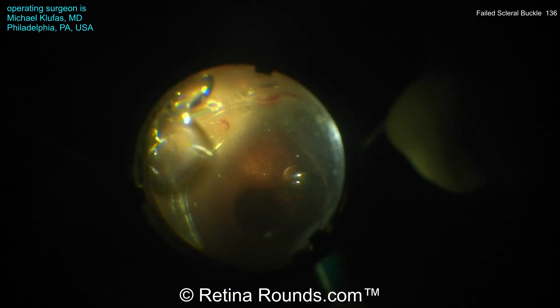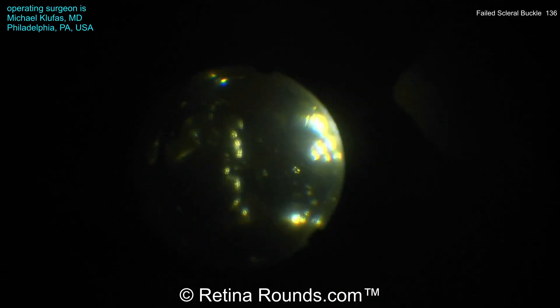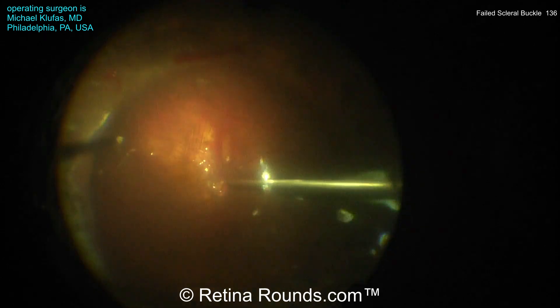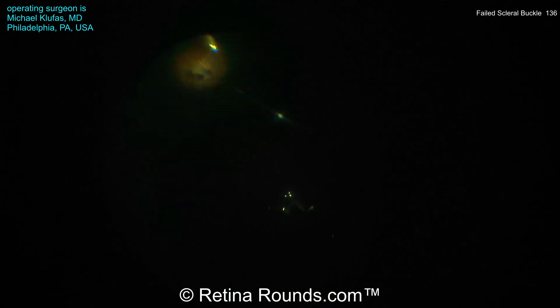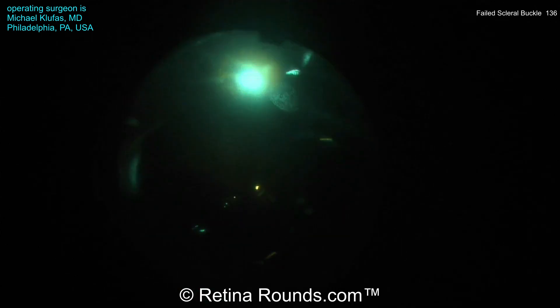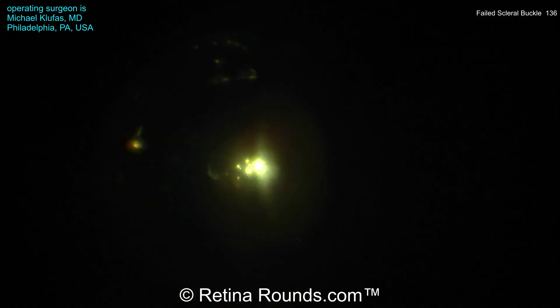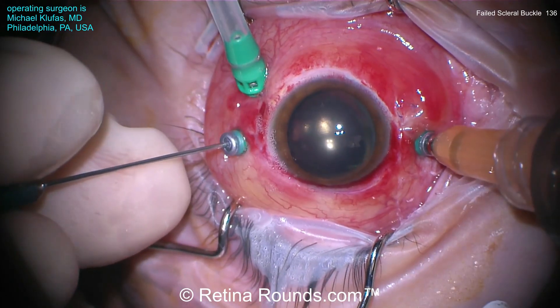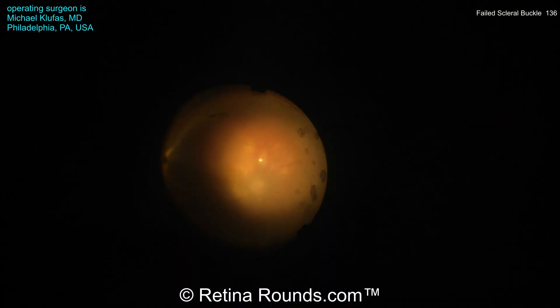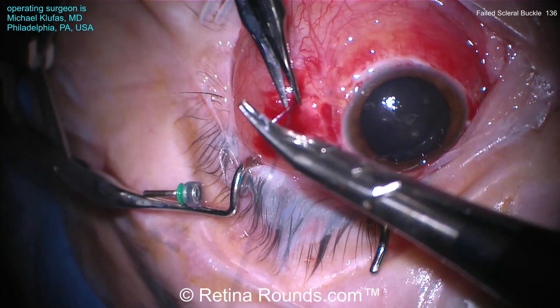Now an air-fluid exchange is being performed, and this is going to allow the retina to flatten, sandwiching the retina between the air that's going to be more anteriorly located and the perfluorocarbon liquid that's more posteriorly located. You can see here that he's elevating up the level of the PFL, and now performing some endolaser around this retinal break as well as some adjacent areas of lattice degeneration. Now that the retinal breaks have been treated, he's going to take down the perfluorocarbon liquid, exchanging for air. Dr. Klufus has opted to implant silicone oil. The reason for this is this patient does not live in his area, is going to need to travel back home, and due to altitude restrictions, he's chosen to use silicone oil. The sclerotomies are being sewn shut using Vicryl suture, and that concludes the case.